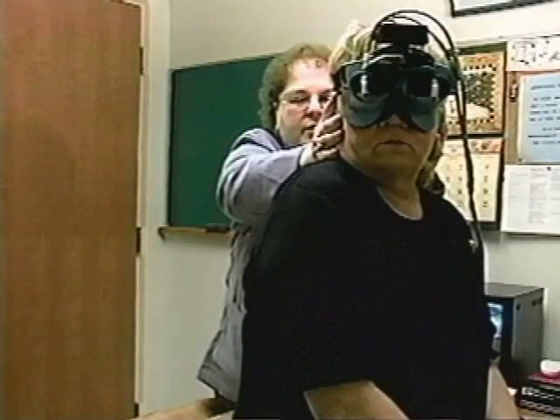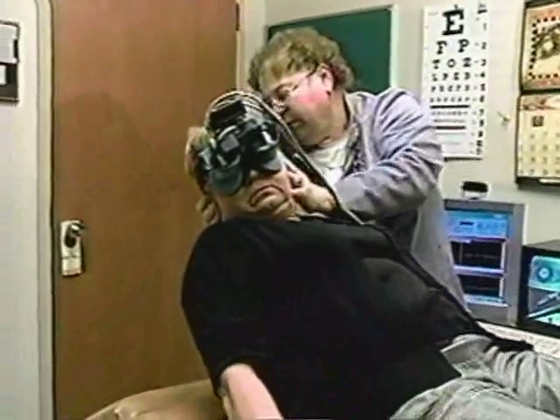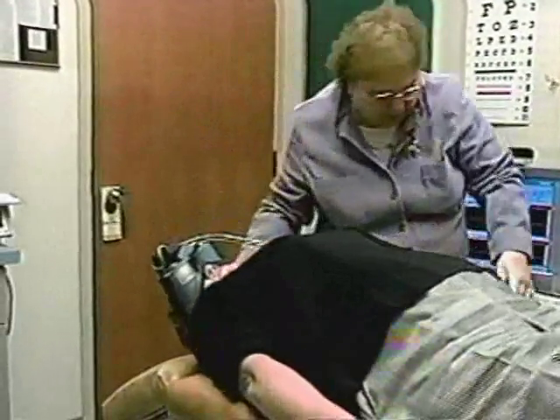The key to the diagnosis of benign positional paroxysmal vertigo, or BPPV, is the presence or absence of torsional, that is to say geotropic type nystagmus, with the rotational component beating downwards towards the earth. The technique of the testing has been discussed in another video, but briefly to review, the head is turned 45 degrees to the left or to the right prior to laying the patient down in a 30-degree head hanging position. Hyperextension of the neck is unnecessary.